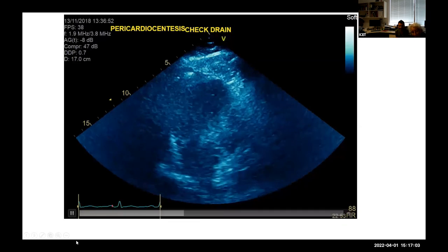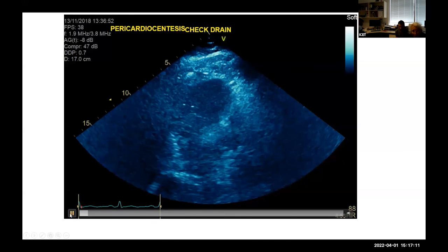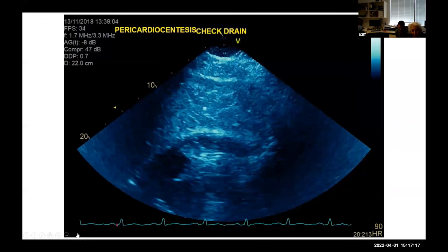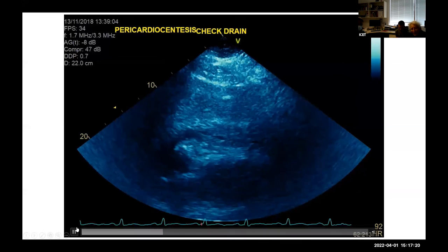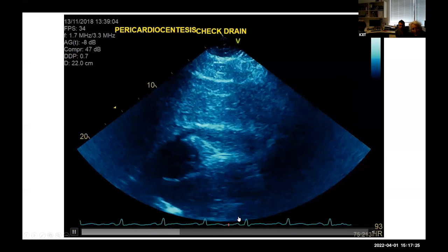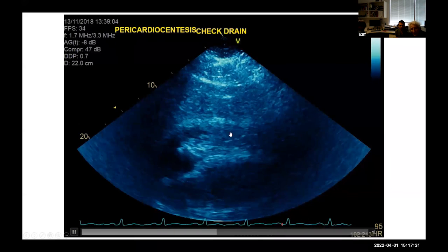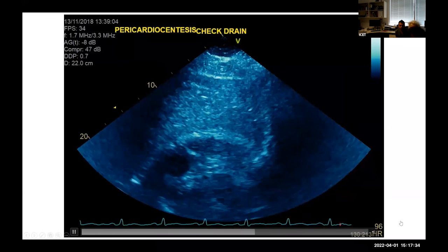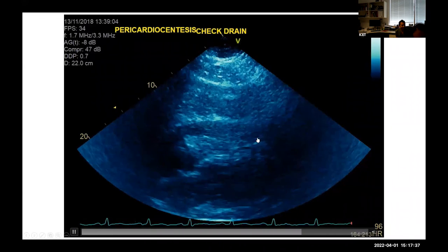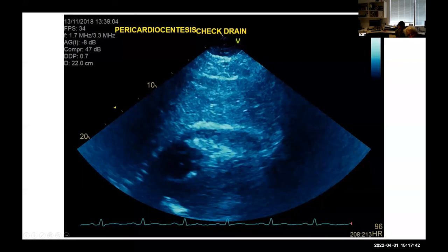Okay, have a look at the next one. Intracardiac bubbles, I think. Press next again. Oh, now the bubbles. Where are the bubbles? They look like they're in the pericardial space there. Assuming the RV is completely down, it's a better shot, a safe shot. You wouldn't know where the other one was, would you? No. Hmm. Okay, and there's a postscript.